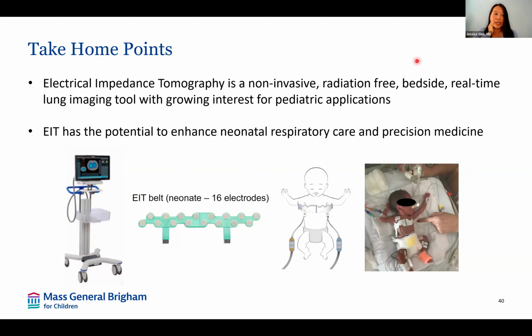And so the second point, certainly when they're paralyzed, it's much easier to read the EIT compared to the spontaneously breathing, because each breath is so dynamic. So we really try to get a representative point in time. It takes a lot from our team to really calm the baby down, give the pacifier, let them relax, try to sleep, and use those regions as more representative to minimize the artifacts and to help with interpretation for each step. That's such a great point.